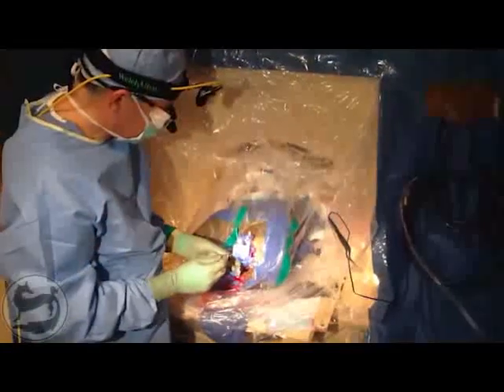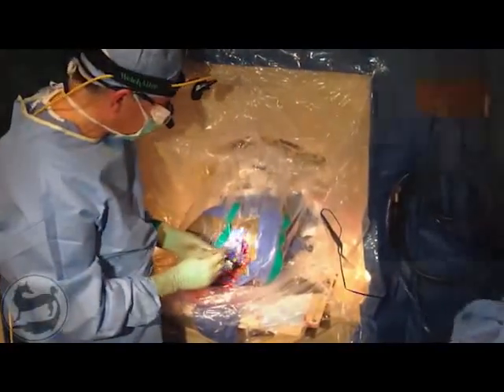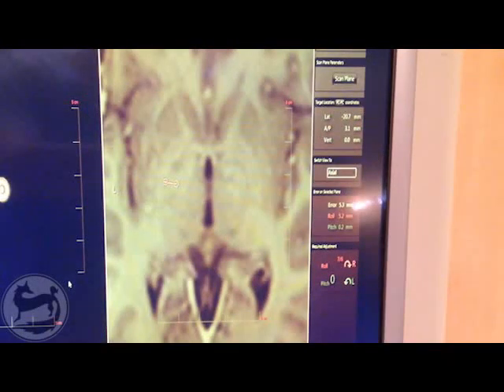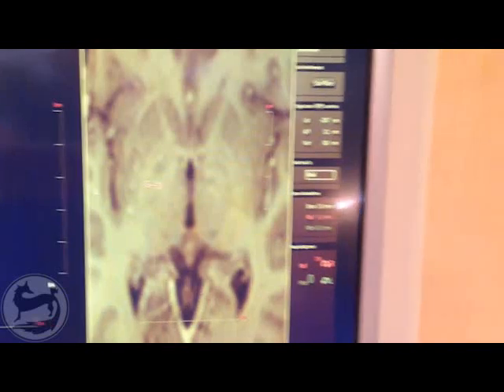The smart frame tower is attached, together with a hand controller, and the patient is moved to isocenter for lead placement. The targeting scans allow for adjustment of trajectory to assure accurate placement. As shown here, the pitch and roll trajectory adjustments are made first.